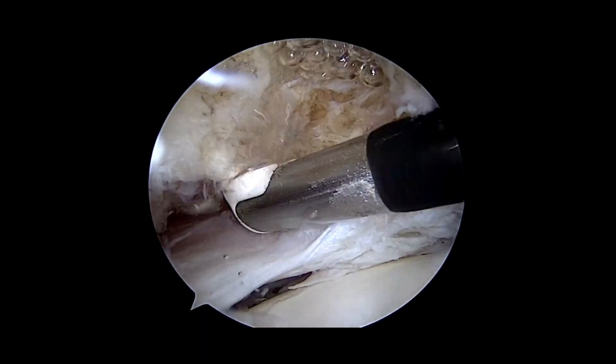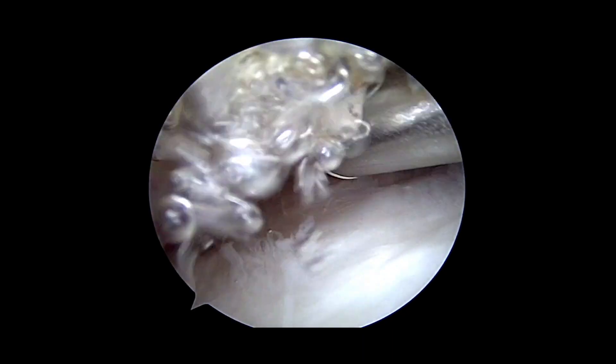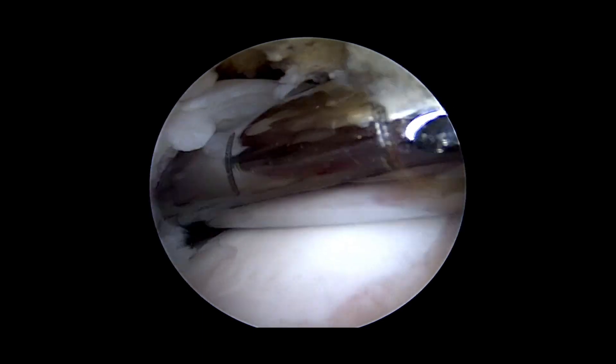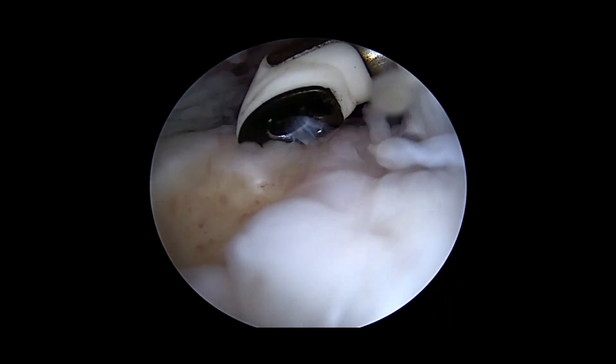We're bringing in the radiofrequency probe to release any adhesions on the superior surface of the tear or the muscle. We're now going to bring in the shaver and debride the undersurface of the tear. Pulling with the grasper, we can see the tear is nice and mobile and easily covers the footprint, so no release is required.